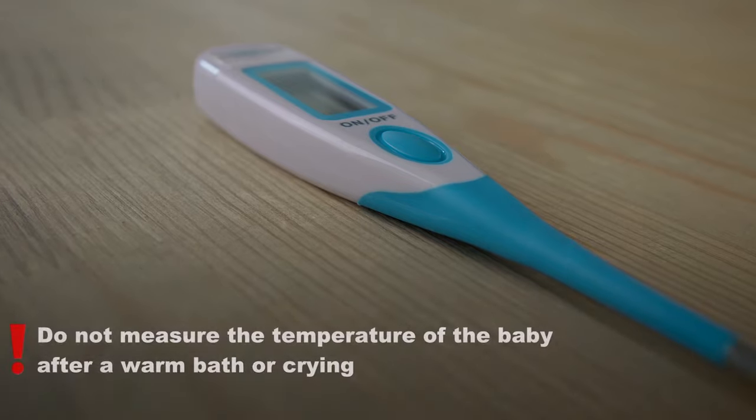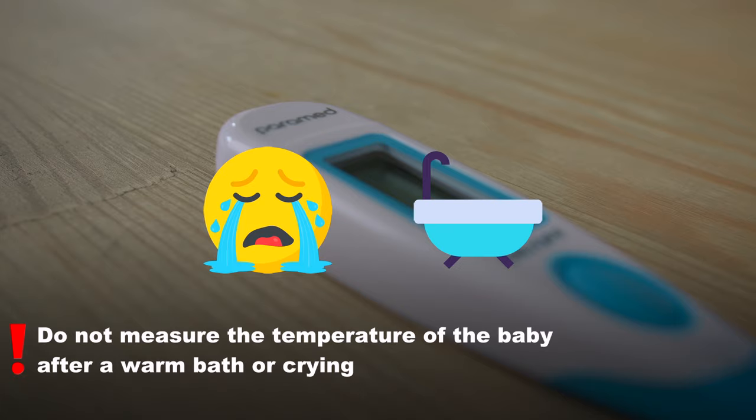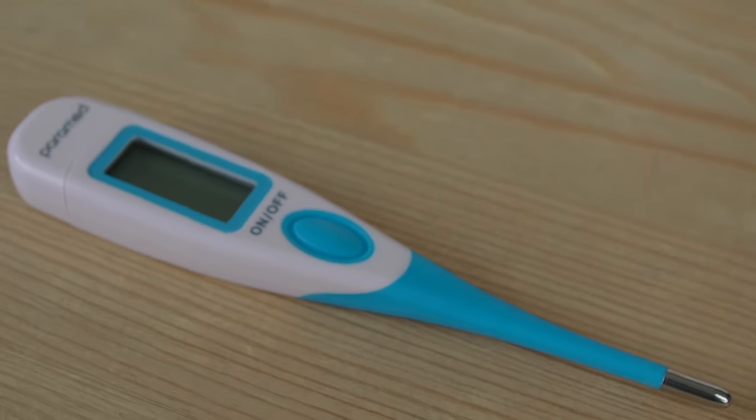For most accurate results, do not measure a child's body temperature after a warm bath or after the child has been crying. These actions increase the body temperature for some time, therefore the results will not be accurate.